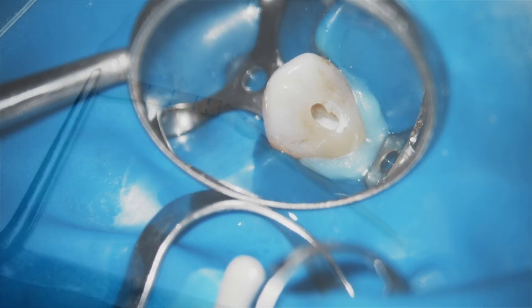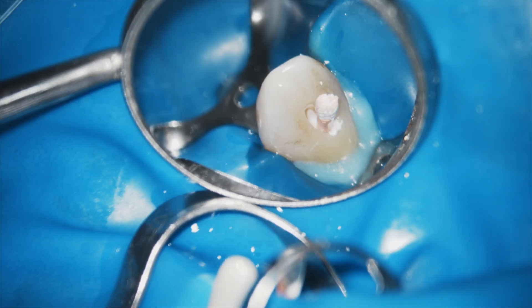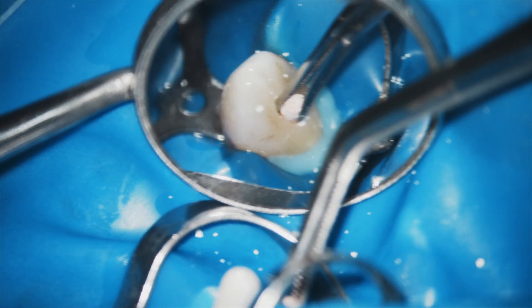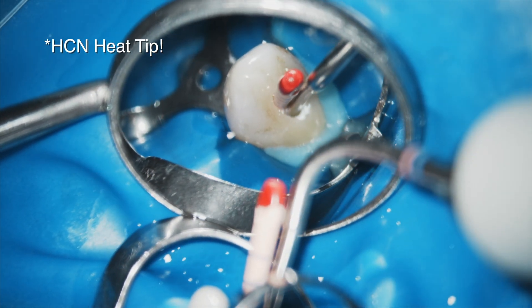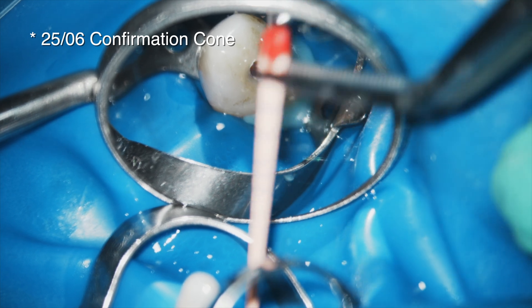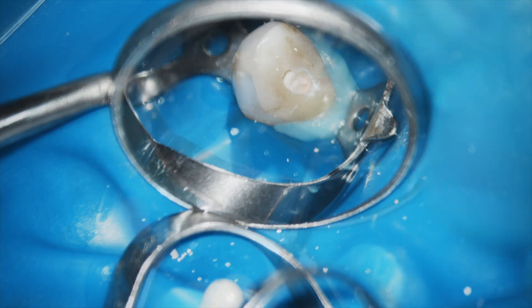You can essentially place a notch about 10 millimeters deep into the gutta-percha cone and place it down, press it, then almost break it off and press it apically, rotating it so the handle comes off. This makes it easier to use hydraulic condensation to close off the rest. Because the canal was fairly oval, I wanted to put an additional cone. This gives me enough room to add the additional cone and use a new hydraulic condensation tip I've developed — not yet launched but coming soon. Two 25/06 cones were placed alongside the main 45/04 cone.